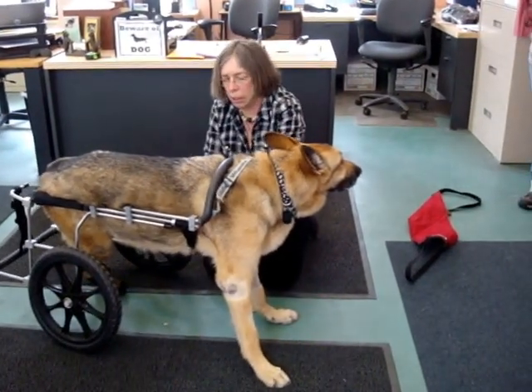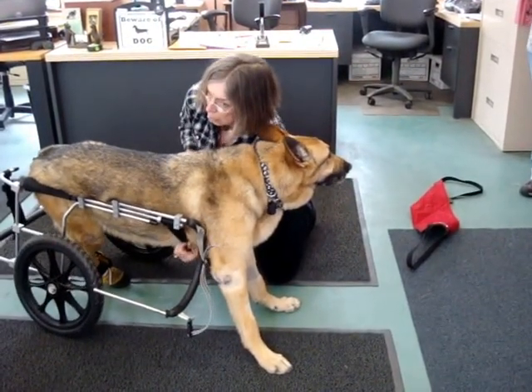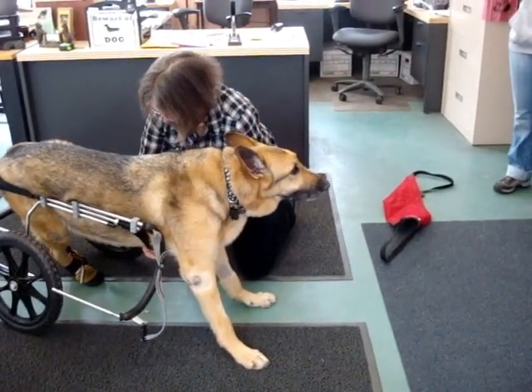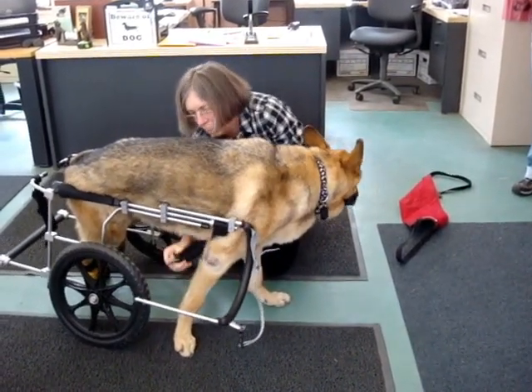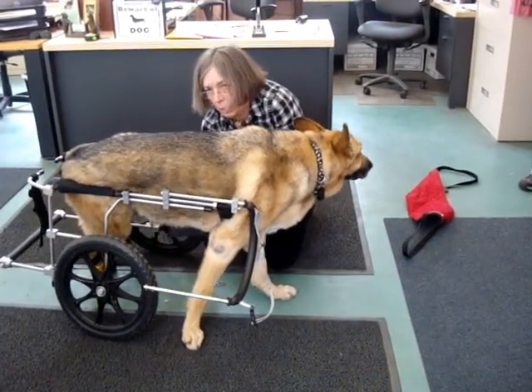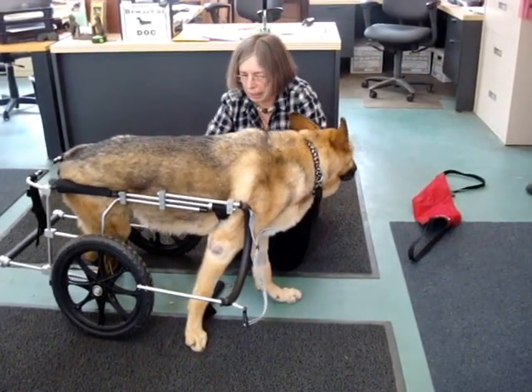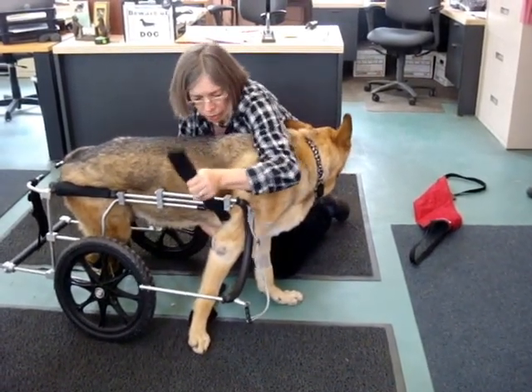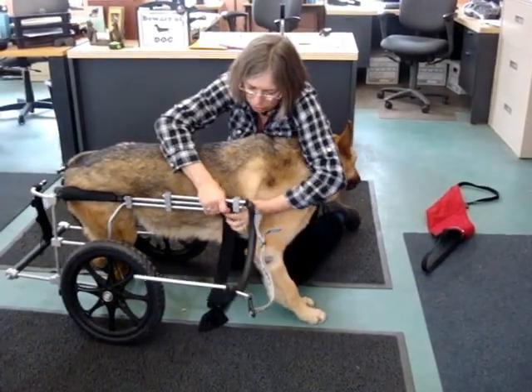So I'm going to drop this for a second and do that. But the dog is being supported by the cart, so it's not in the seat. So I'm doing this in order to make the yellow belt up on the shoulders. Right now the support strap is too tight, so it's pulling the yoke down hard against his shoulder blades.